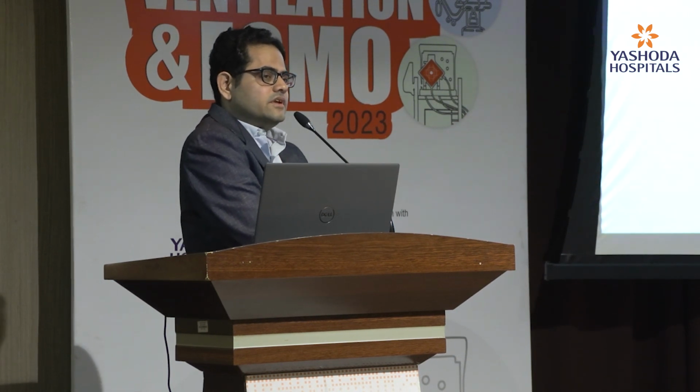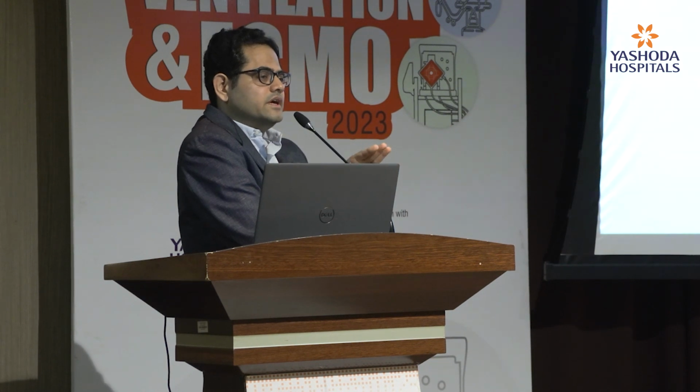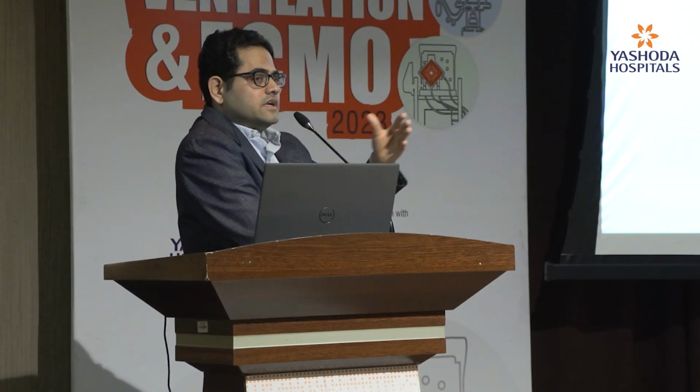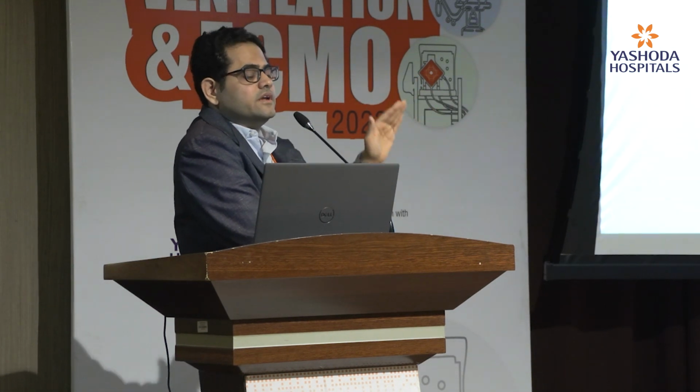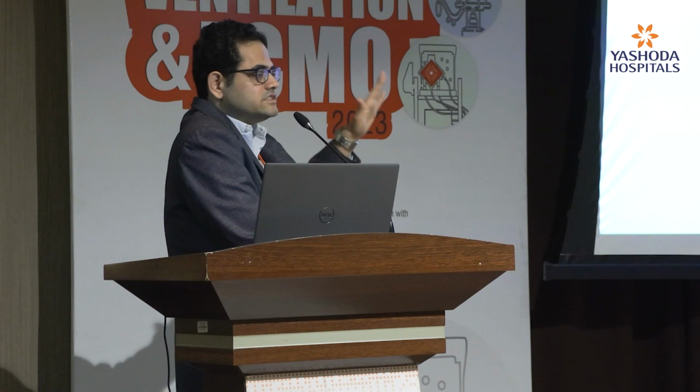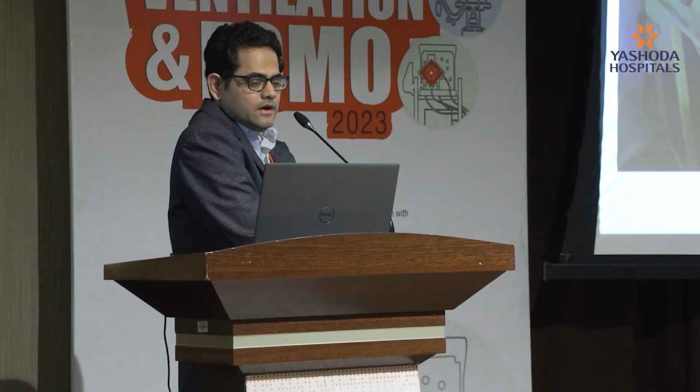On the contrary, when ventilating a patient with COPD, the time constant is significantly high, so the time required for the alveoli to empty is significantly high. There we cannot ventilate with a higher respiratory rate. We have to use a low respiratory rate. That is where the concept of time constant comes in.